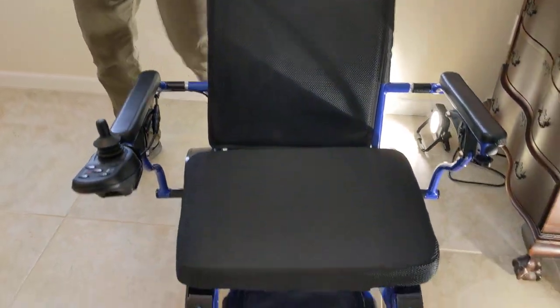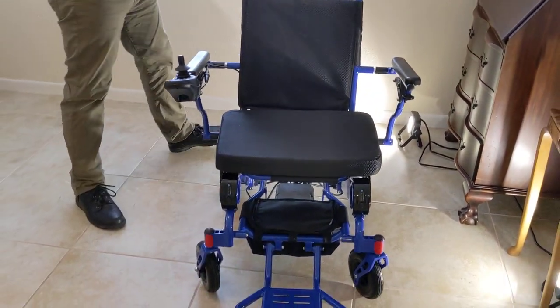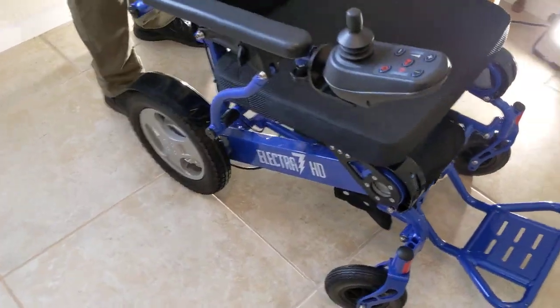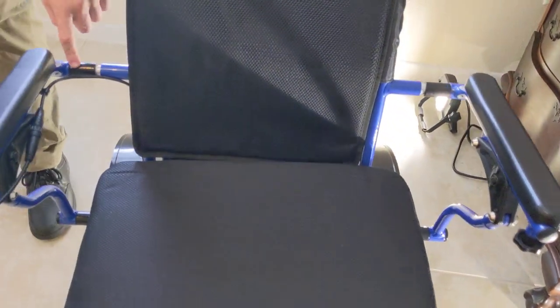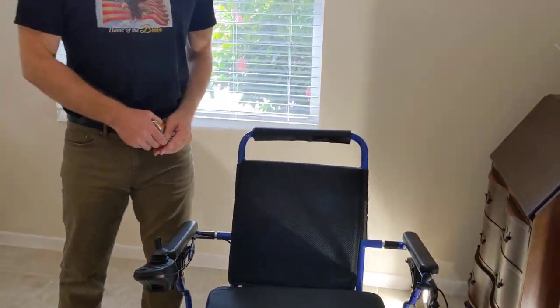Now what we're going to do — before anybody actually gets these spacers for their Electra, we have to think about how the chair is going to be used. I'm going to attempt to go through a doorway. You can see there are the armrest extensions — one there, one there, and one on the bottom of each arm as well, so top and bottom. Separate videos have been made about their installation.